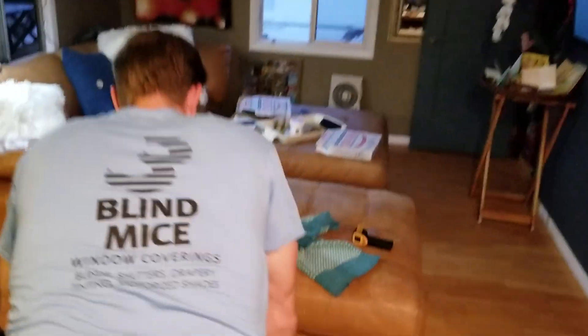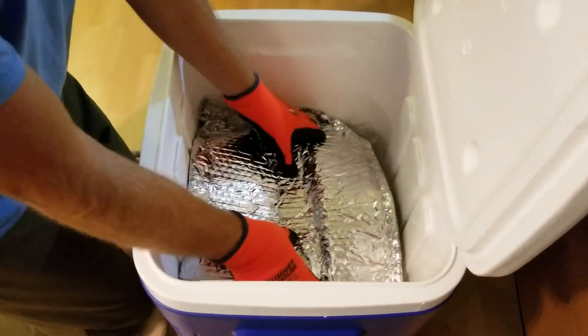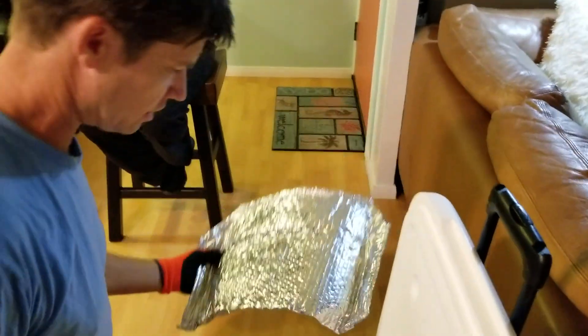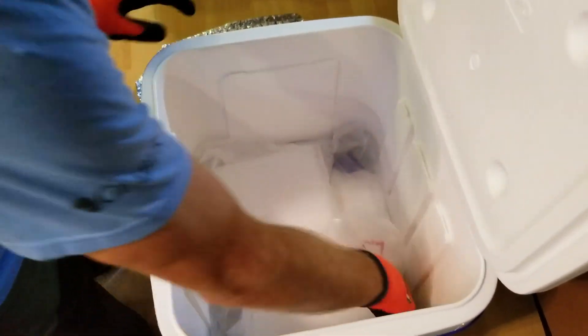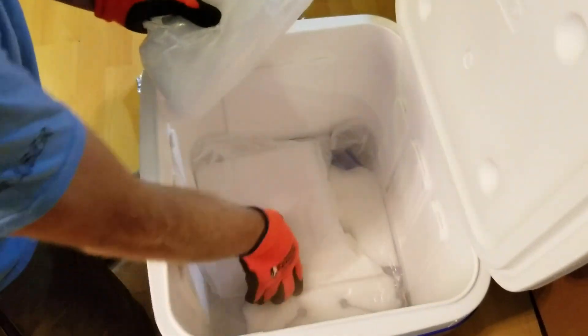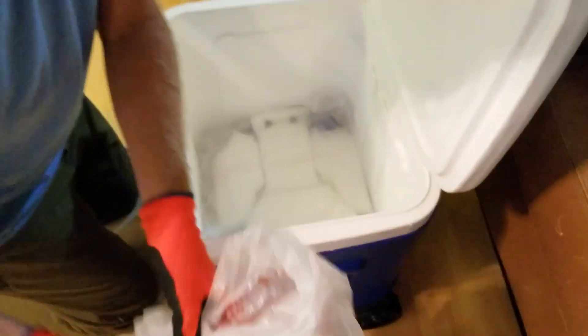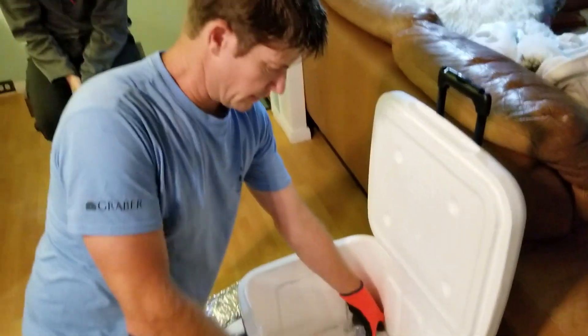We've got a cooler here — it's like a vapor barrier cooler we got from a dry ice chocolate delivery. What we have here is about 50 pounds of dry ice. She picked that up the day before. We try to keep it in the bags so it doesn't off-gas as much and it's easier to handle.